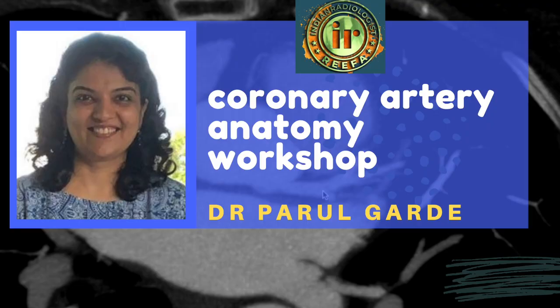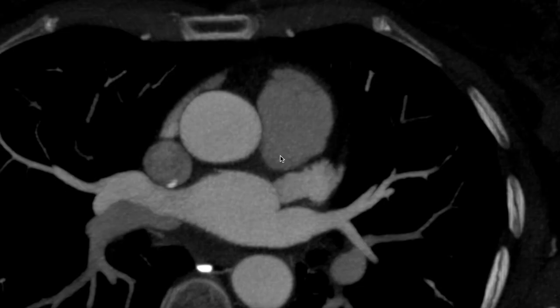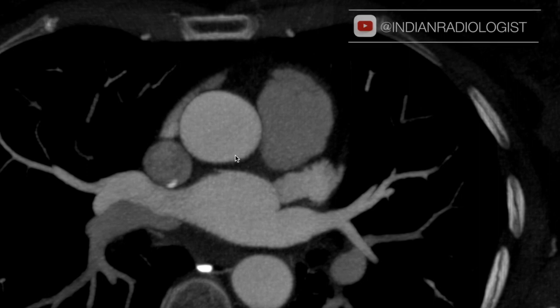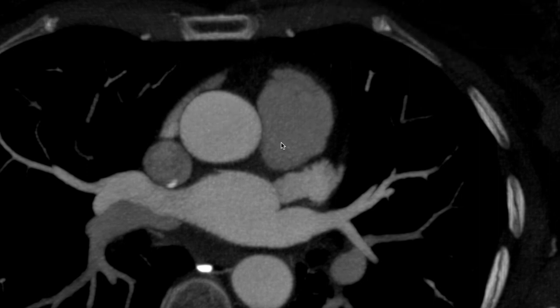Before we go on to understand the coronary arterial anatomy, let's quickly look at the cardiac chambers on axial CT. Scrolling craniocaudally, on this first image we have the ascending aorta on the right side, the main pulmonary trunk on the left side, this is the left auricle, and the posterior-most chamber here is the left atrium.